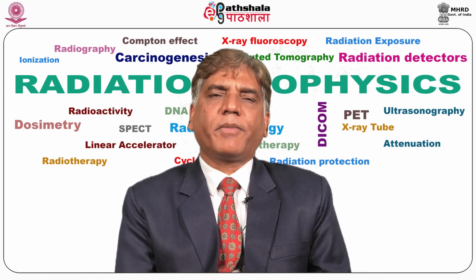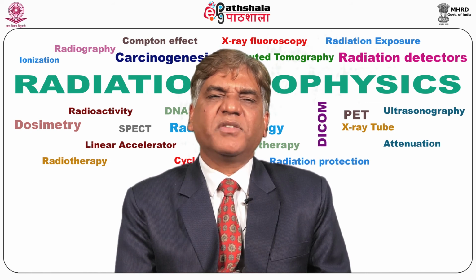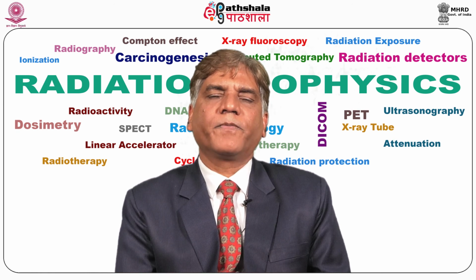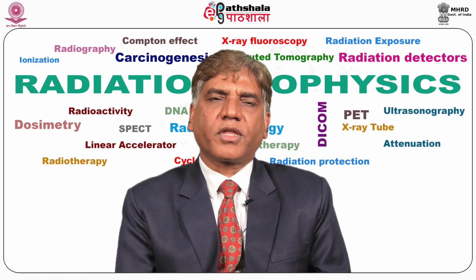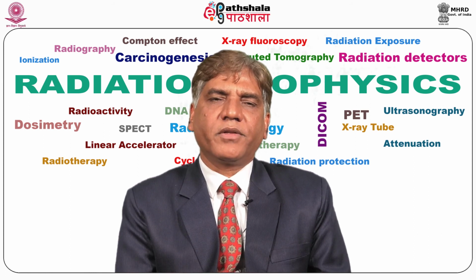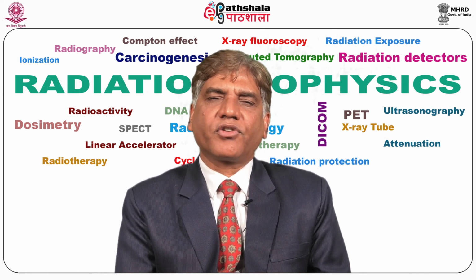Now the advantages of PACS. The advantages of PACS include increased efficiency of acquisition, viewing and recording of images, efficiency in data management including fewer lost films, cost saving, space saving, environmental benefits, and increased efficiency of retrieval of historic images.